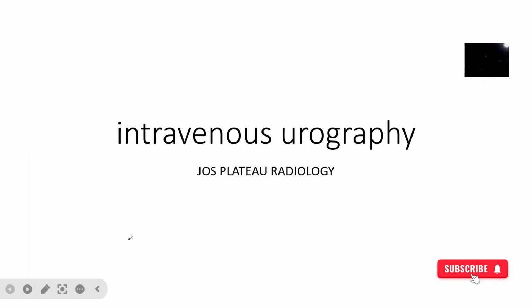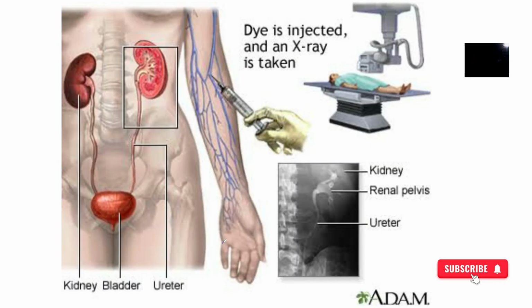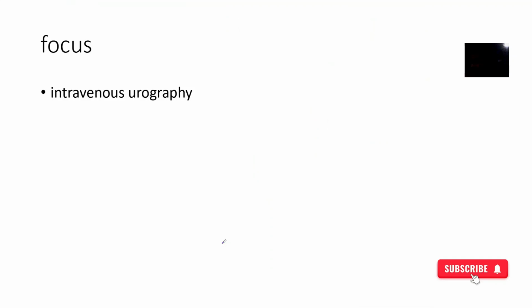Now we try to look at the next modality that actually helps us in imaging. So I'm looking at the intravenous urography. And anytime you hear them saying anything uro, it just has to do with the urinary system. Okay, so anything uro is urinary system.